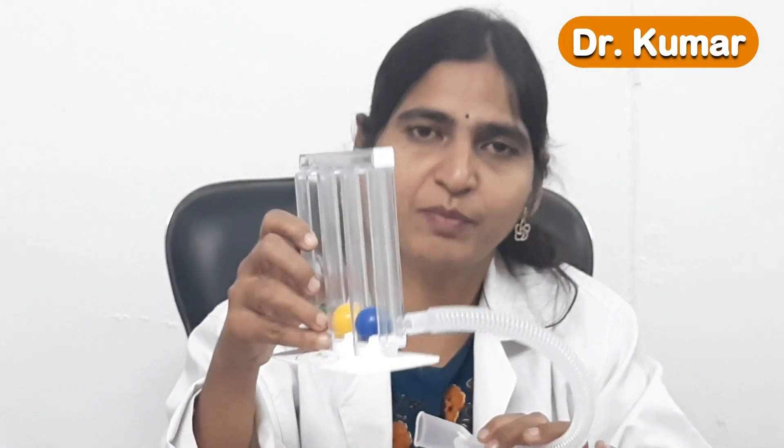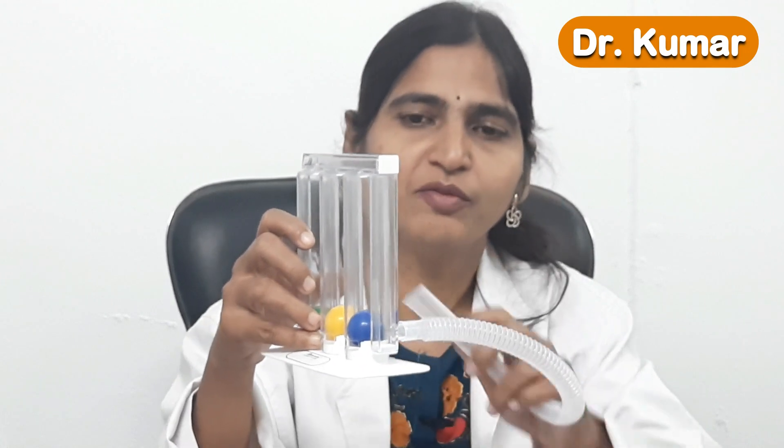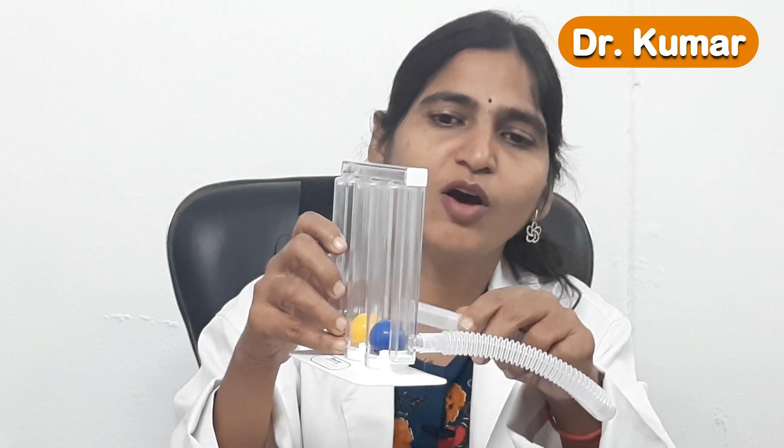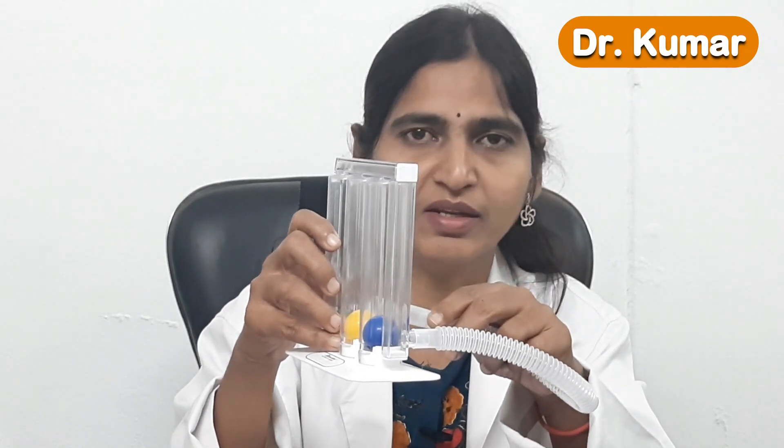This is how the balls will move depending on the effort done by you. The movement of the balls provides feedback so that we can know our lung capacity and how much air we are breathing in.